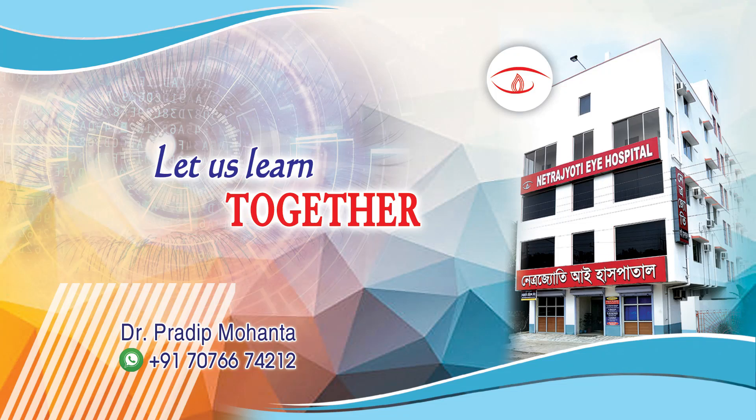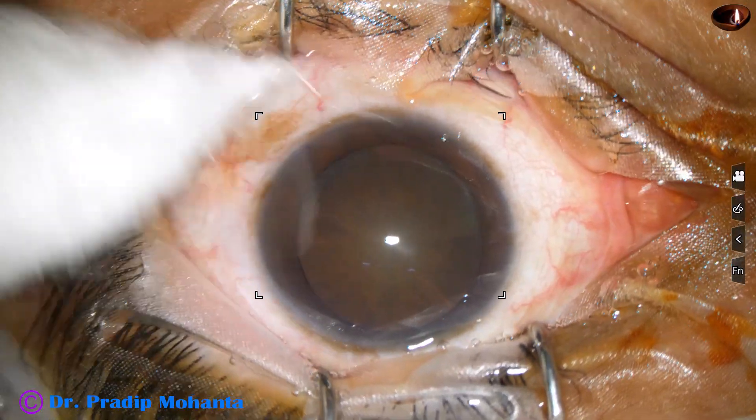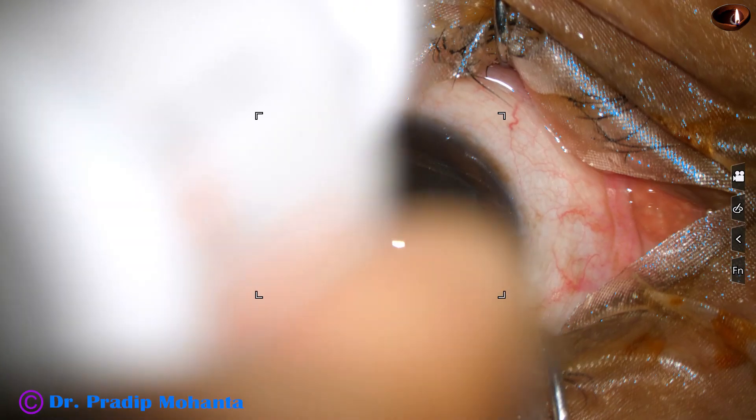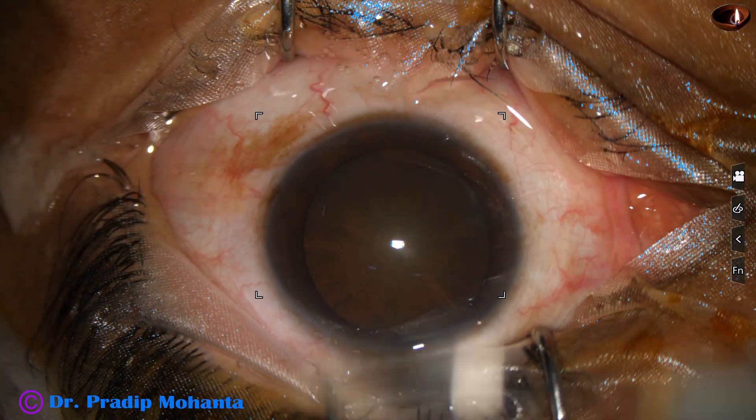Friends, welcome to my workplace at Rana Ghar, West Bengal, India. In this video, we are going to see an unedited recording of management of a soft cataract.